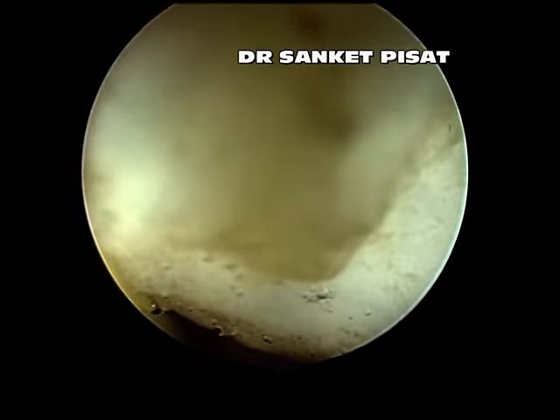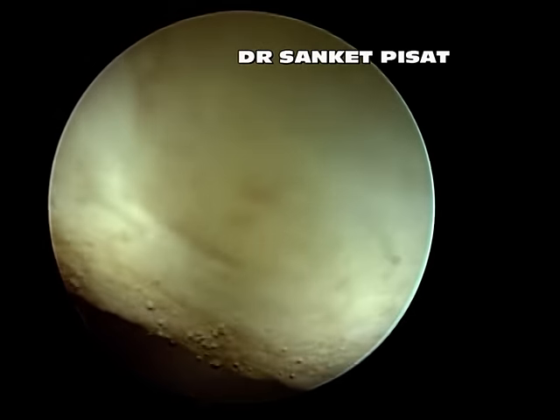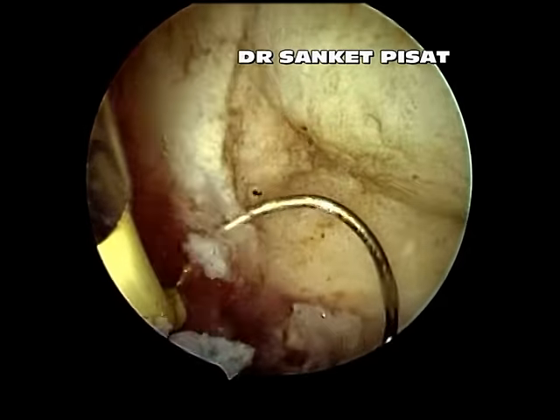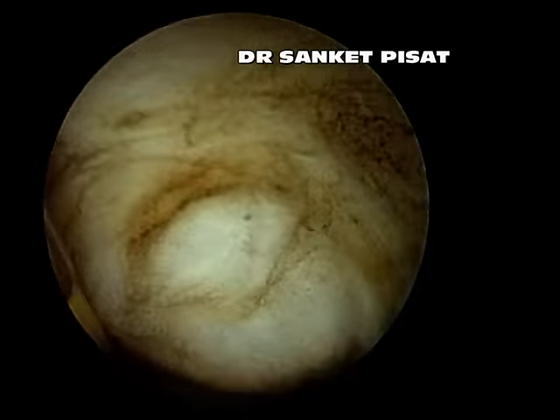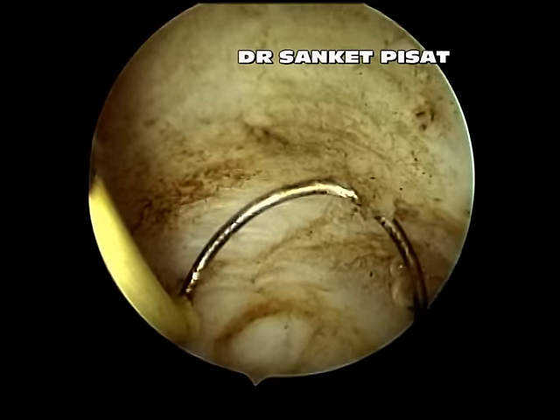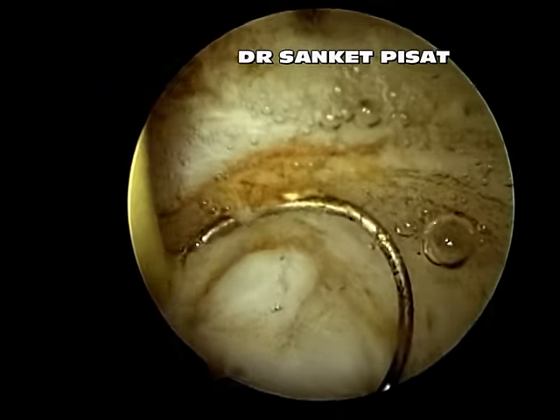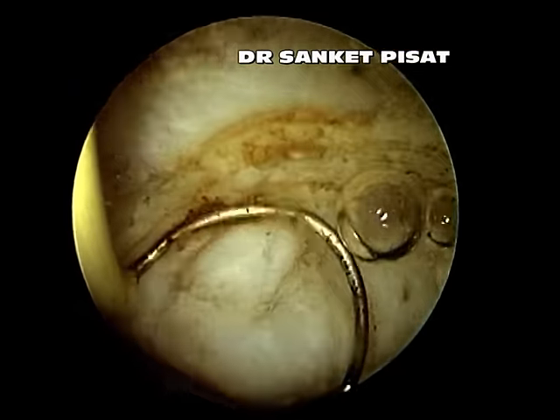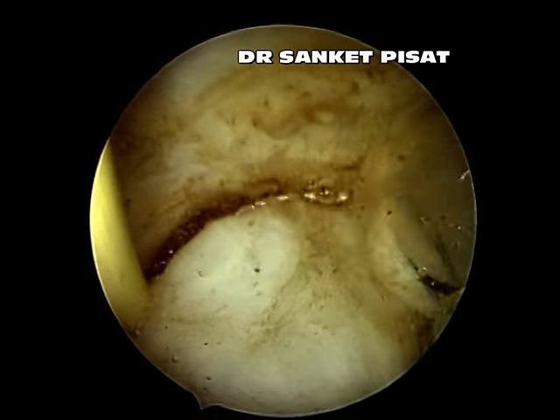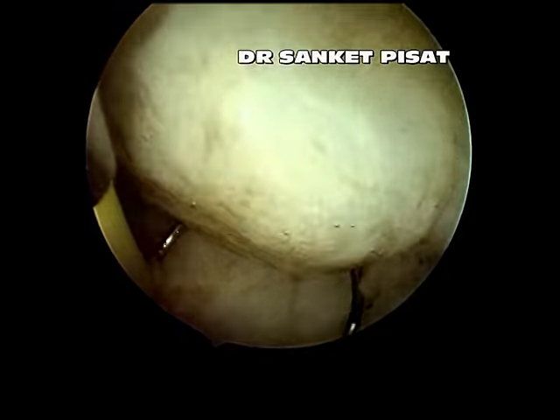As we can see here, the fibroid is slowly but surely getting displaced towards the endometrial cavity until such a point where the loop of the resectoscope is able to be placed behind the fibroid and is able to actually lift the fibroid away, exposing the normal pink myometrium behind the fibroid.